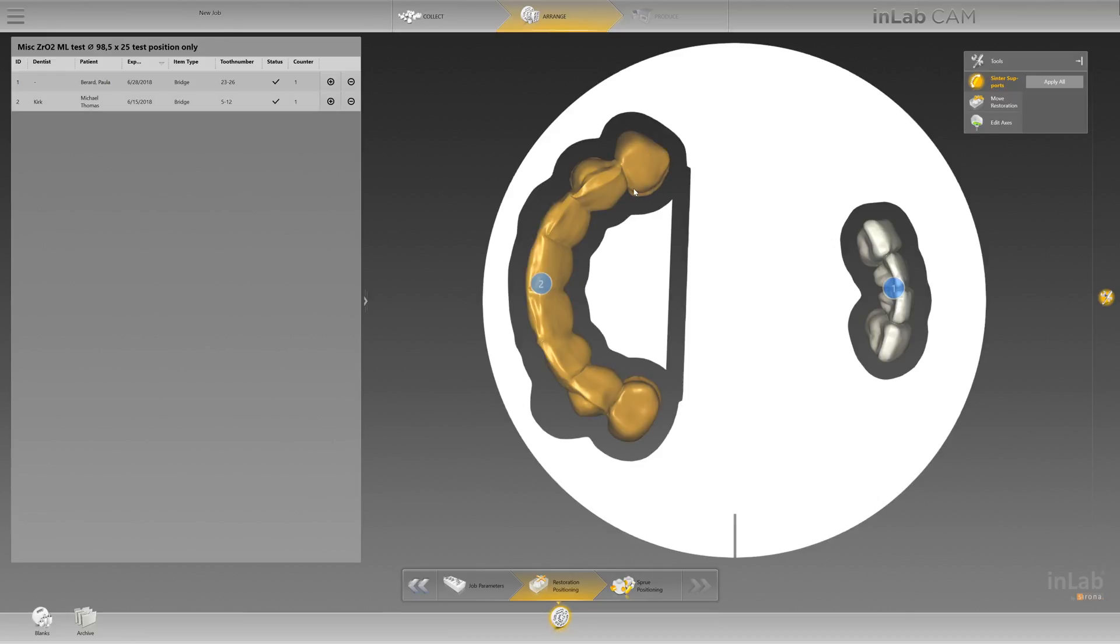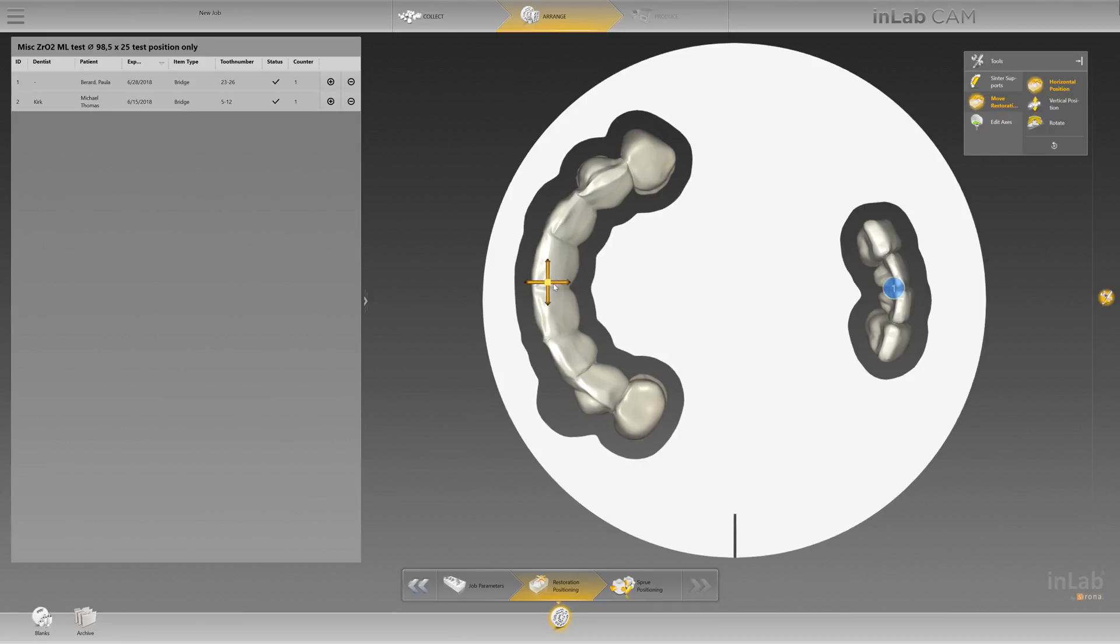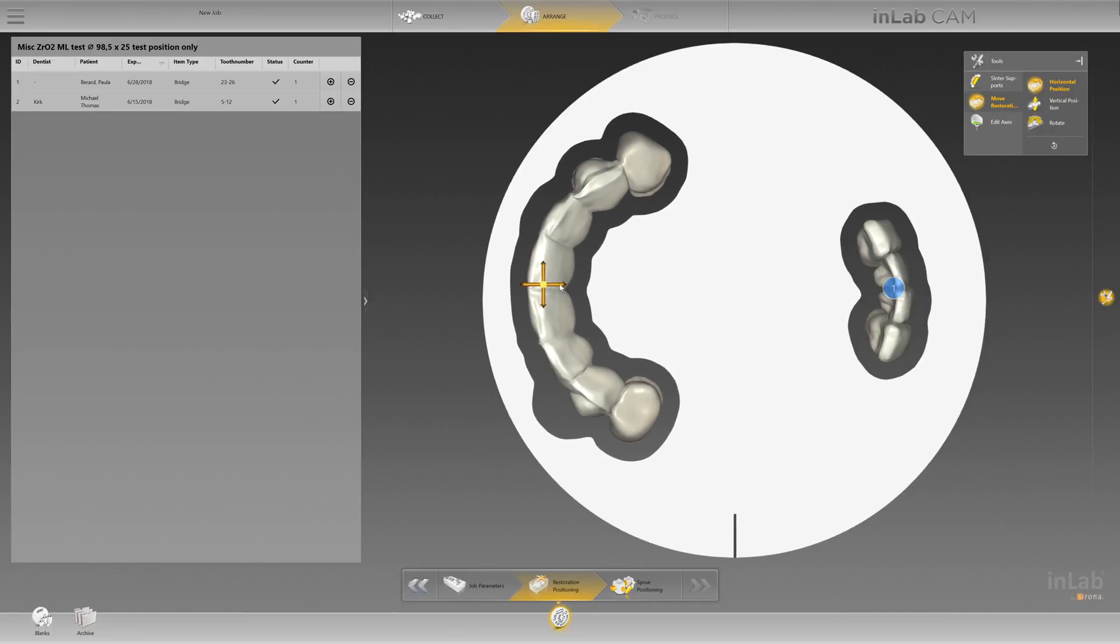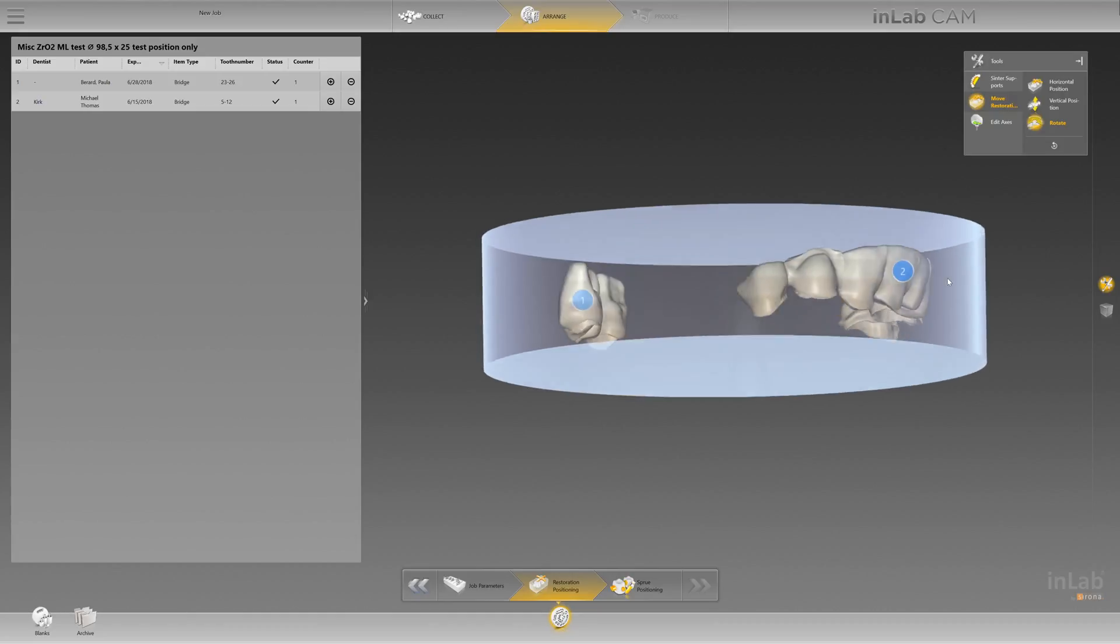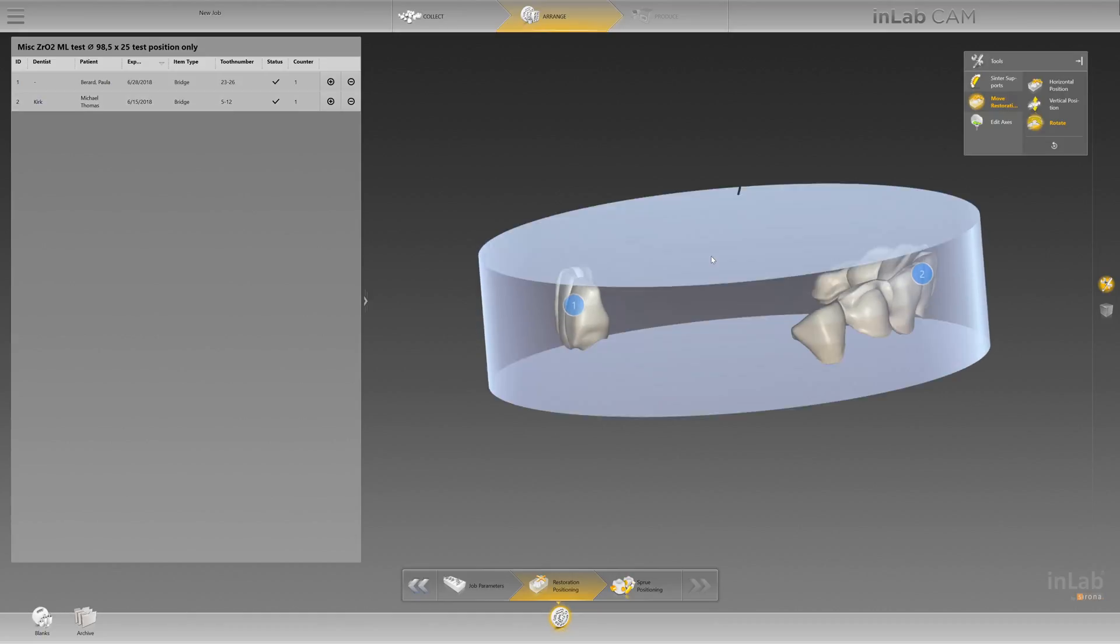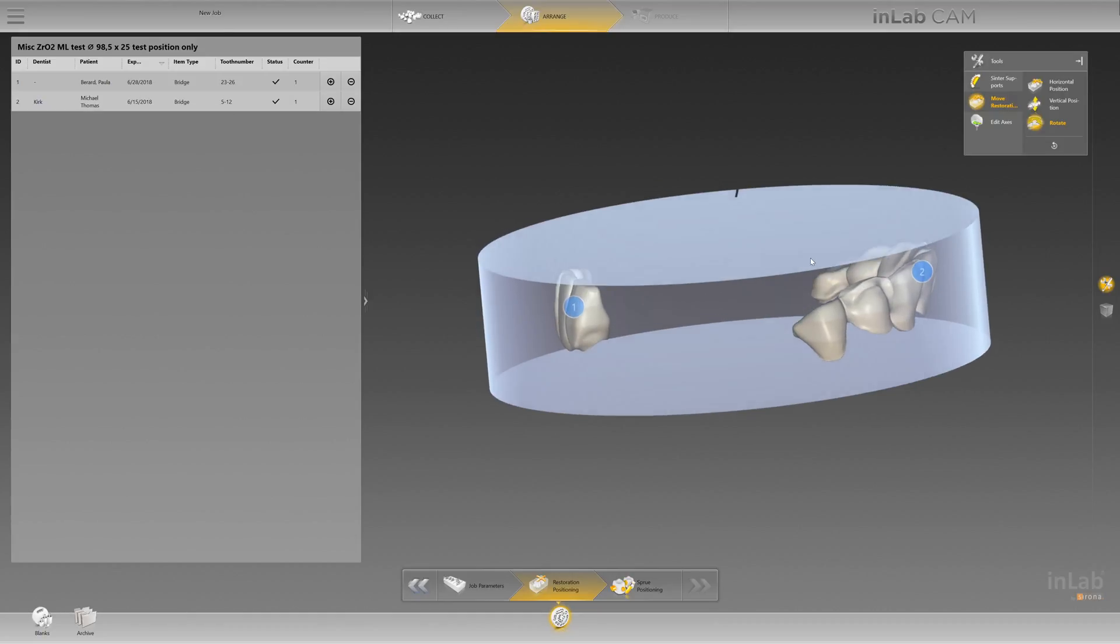Next is the move restoration tool. You can move this pretty much globally however you want to move it - horizontal, vertical, rotate it in whichever fashion you want. Works very well, especially when you're looking at multi-layer materials.